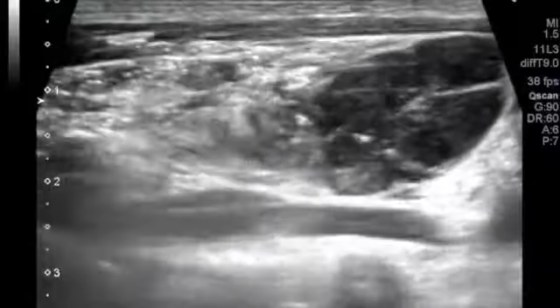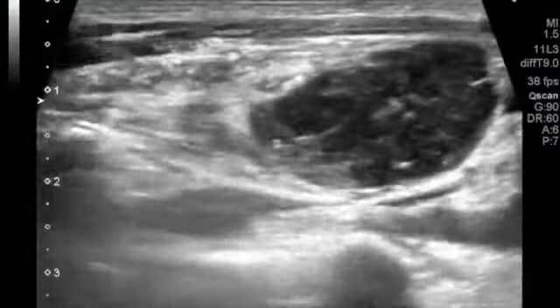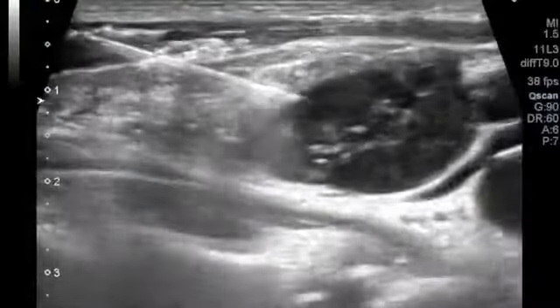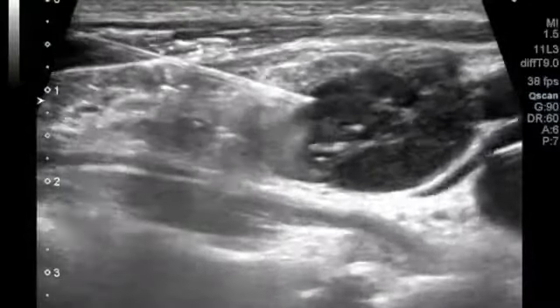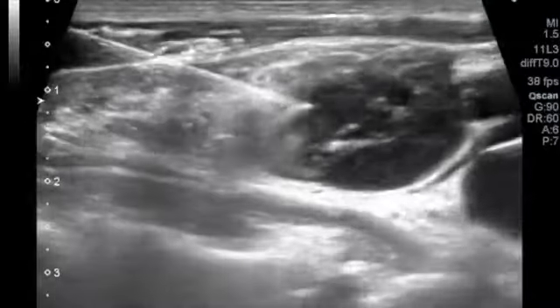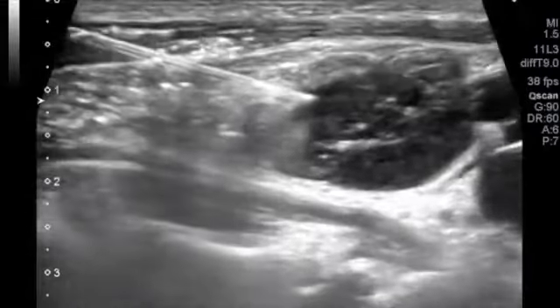And when we diagnose an abnormal or diseased node, it is best to undergo a guided sampling. Now in sampling, a true cut biopsy is usually preferred over an FNAC. And I have these nice pictures sent by Dr. Vishal Kumath, in which we see a nice simple video of lymph node biopsy being done.